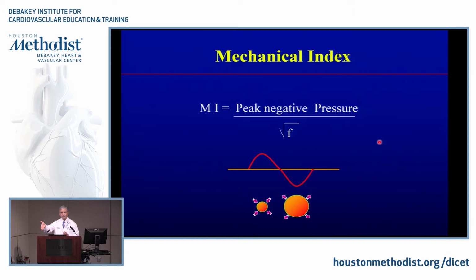Now, ultrasound, for medical purposes, is regulated so that you won't harm patients, right? But you know that you could have ultrasound energy that is so high that you could break gallstones and you could break renal stones. And you could concentrate it in a way that it can be delivered to the place that you want it with an incredibly high energy. So this mechanical index, you cannot go beyond a certain mechanical index because this is what ultrasound regulation is about.